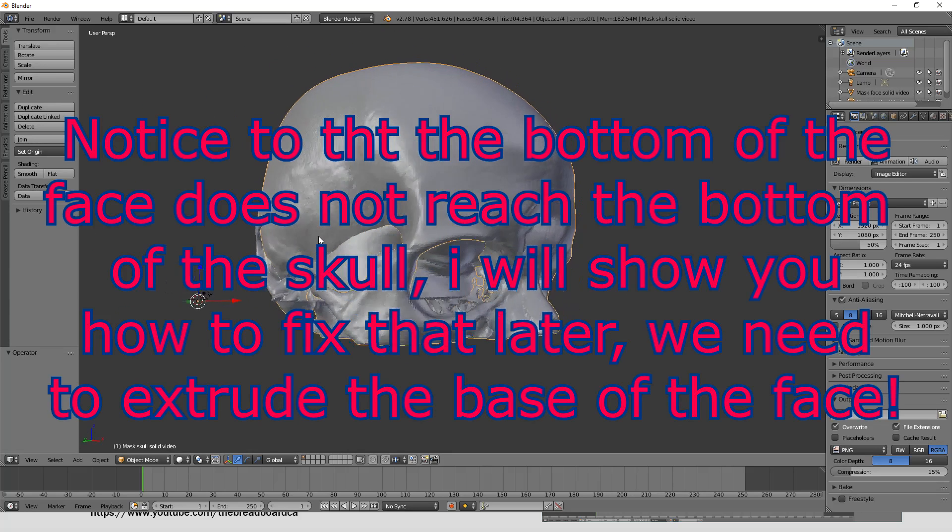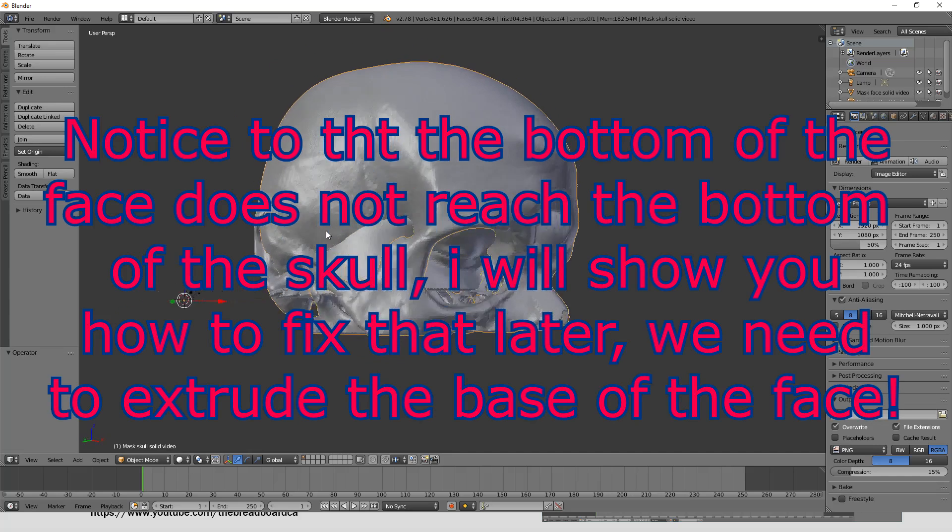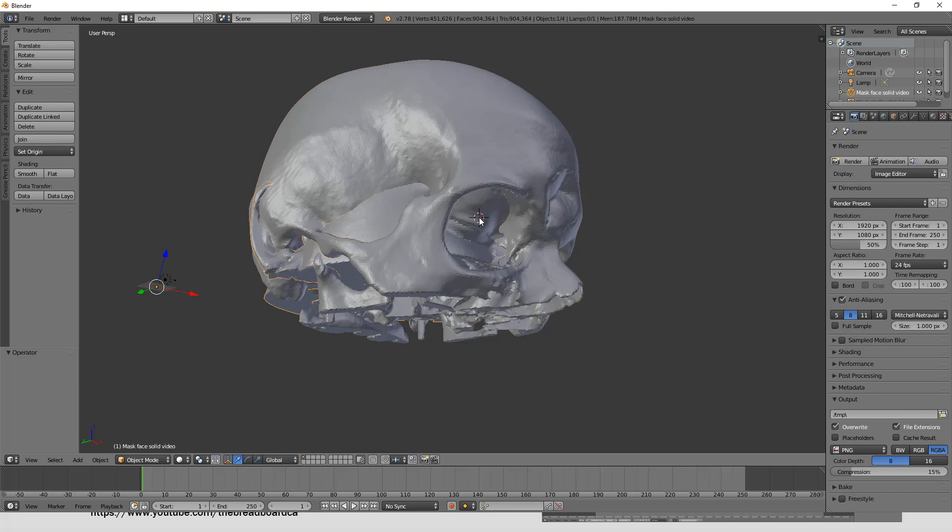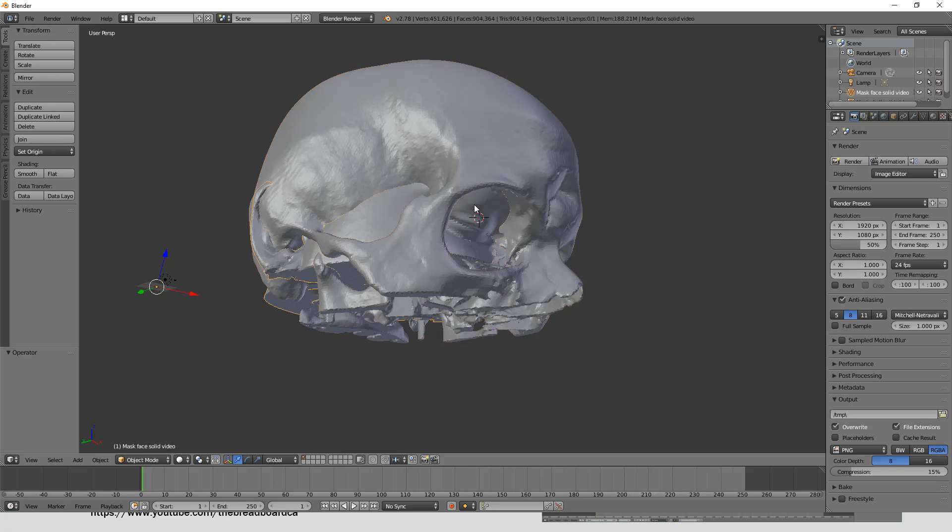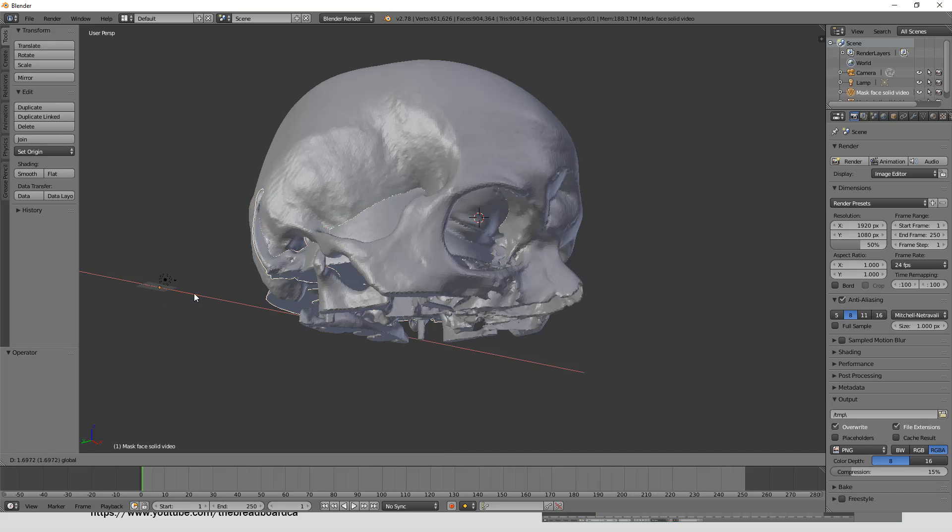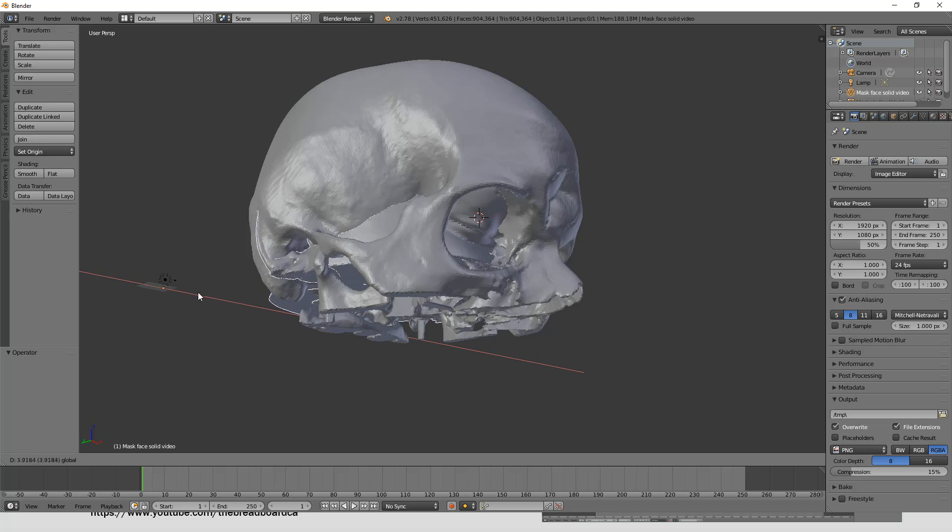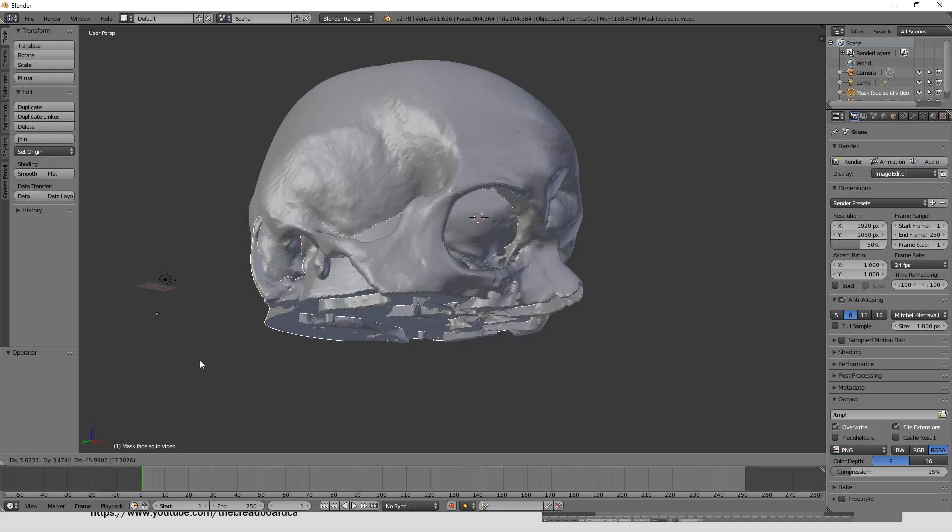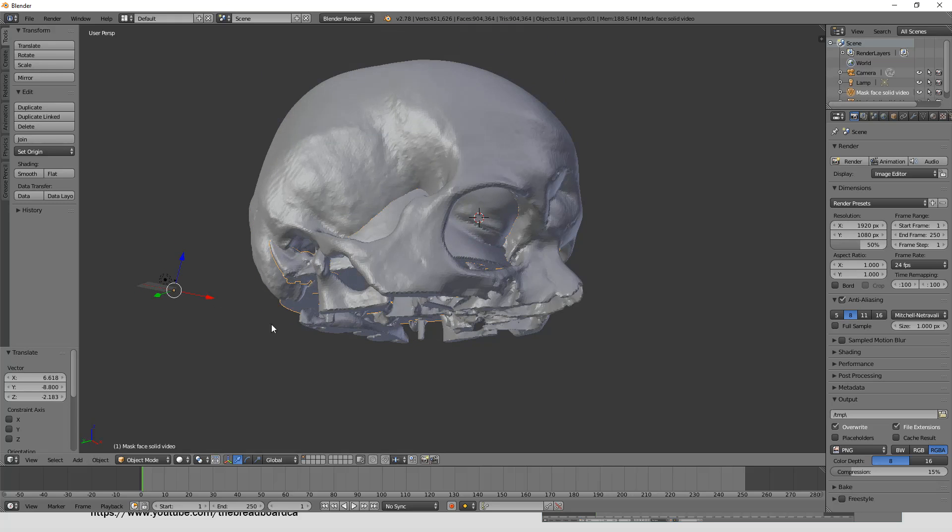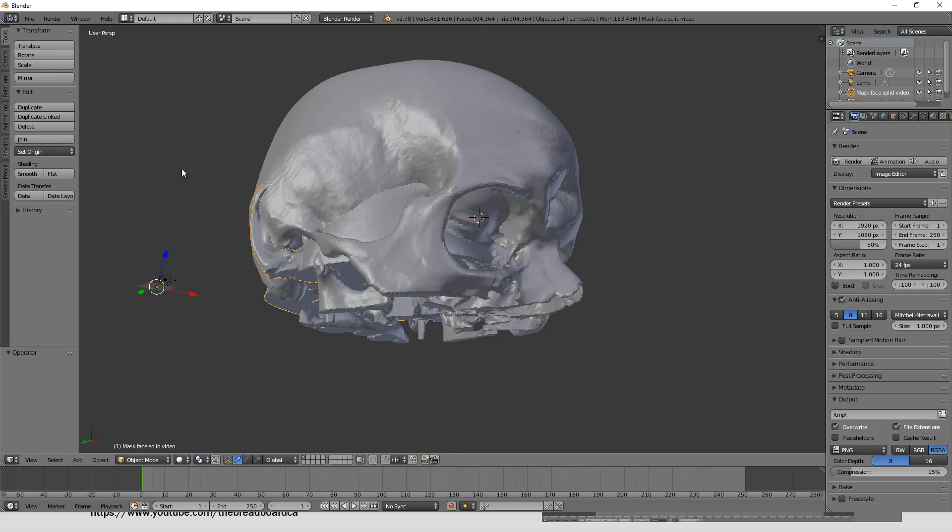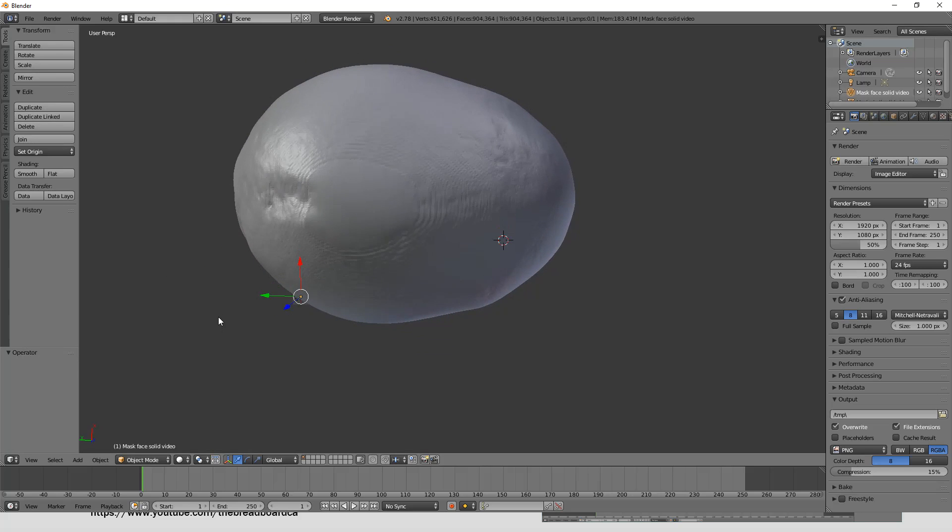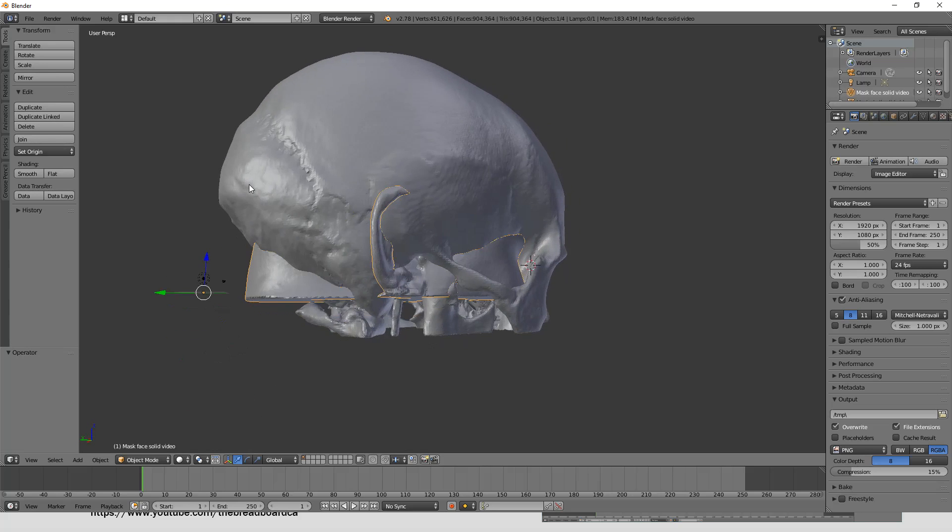And what we'll find now is that, and I shouldn't have done that. Control Z is your friend. I just put it back to where it came from. Different tools, different buttons for making the model turnable. So I'm just going to turn this around. You can see here now that the face is fitting right inside the skull, which is great.